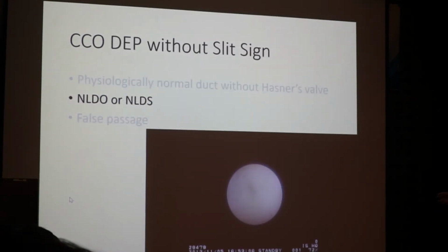I'm in the common canaliculus, and targeting the dimple, I'm pushing the endoscope tip. After depth, what I can see is not the slit sign, but dirty pus. So this patient has common canalicular obstruction complicated with dacryocystitis.